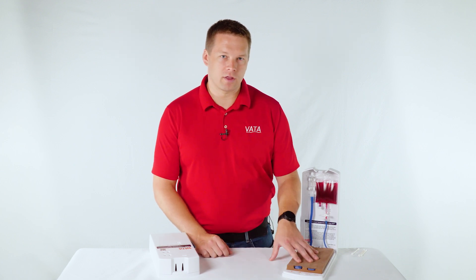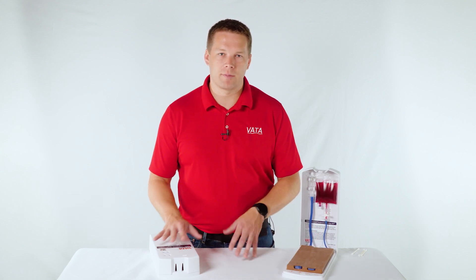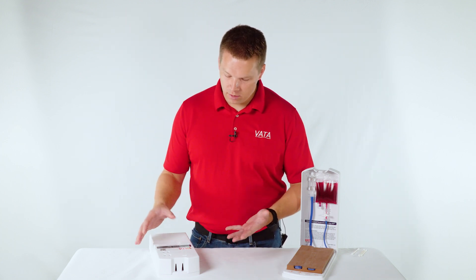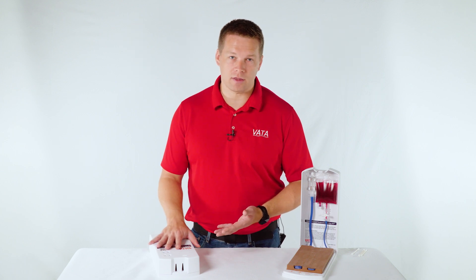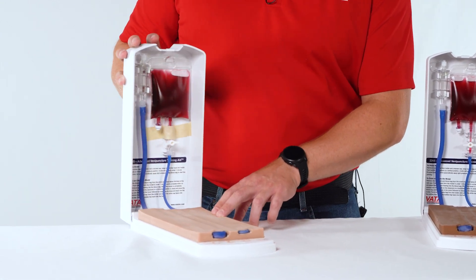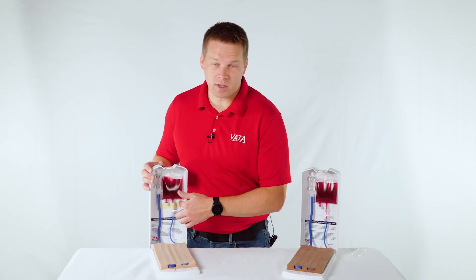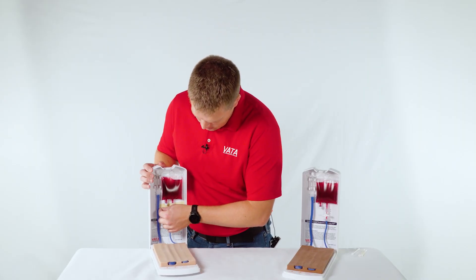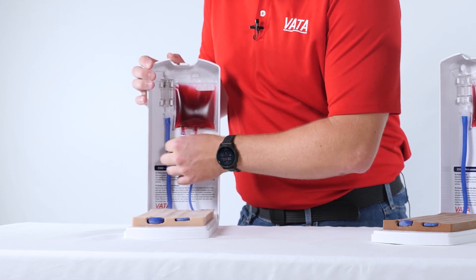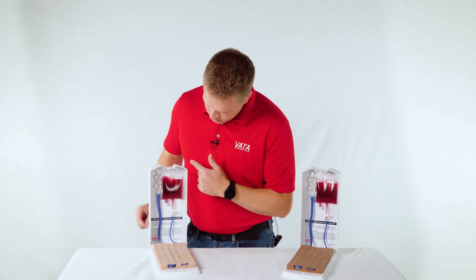To start off, we already have our 2366 opened up, but with our 2365 here I'm going to go all the way through the process of getting it ready for use in real time. When the model gets to you, it's going to come just like this. You open it up by pushing in on the end — there's a snap feature — open it until you hear the click. Then you'll find some tape on here that's just in there for shipping to hold it in place, since the shipping process can get a little rough. To use it, you're just going to remove that tape.